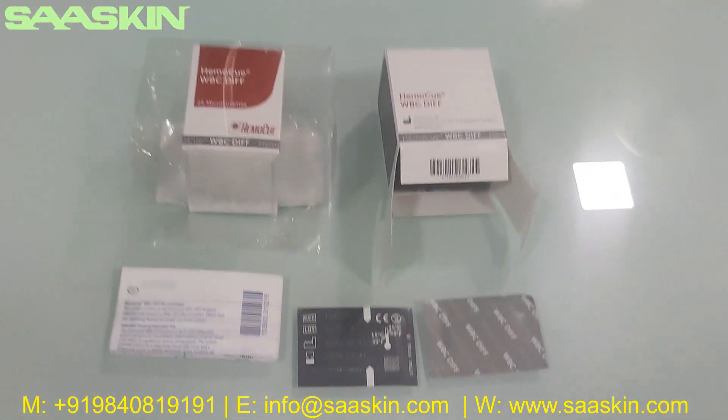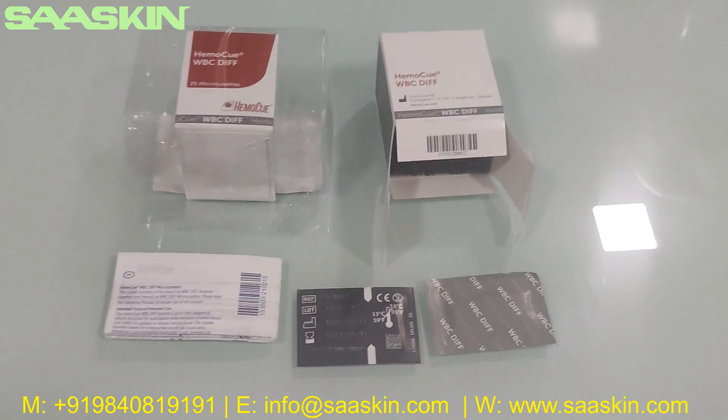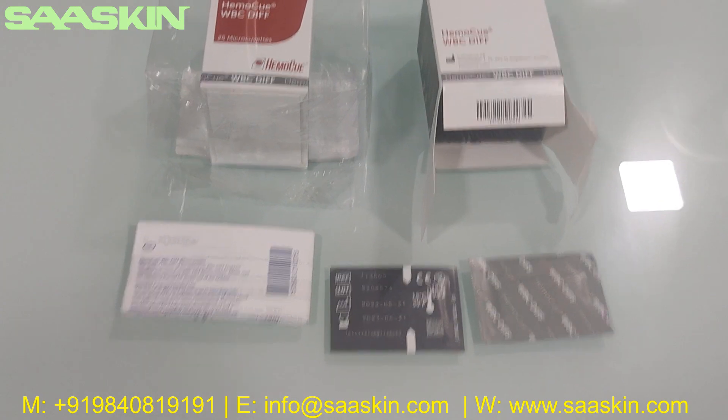You can see here it is certified. This is the quick complete summary about the unboxing of HEMO-Q WBC differential microcubets.